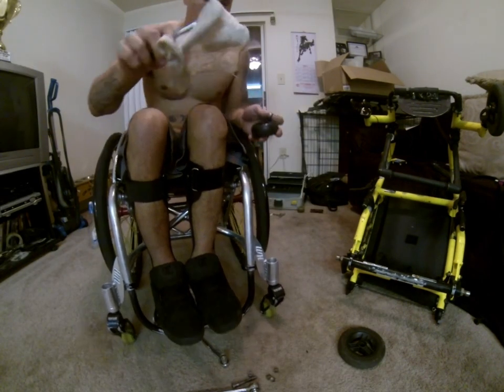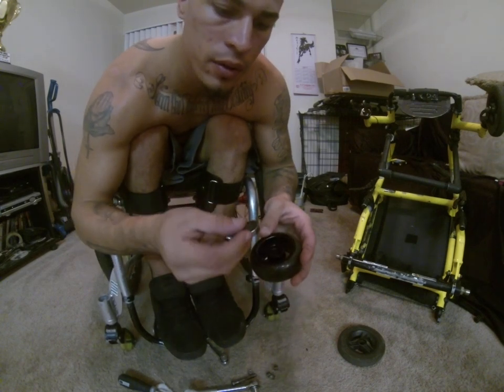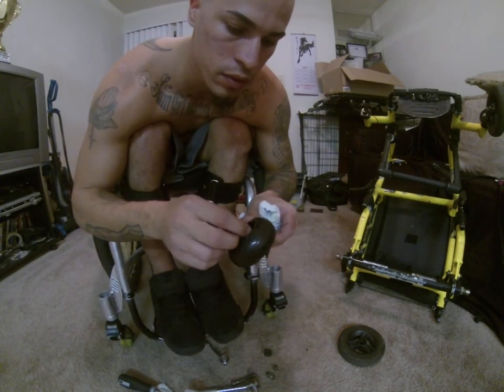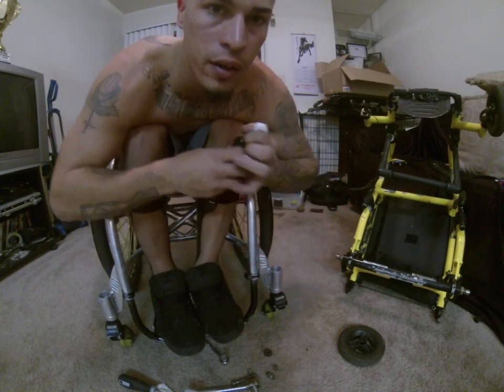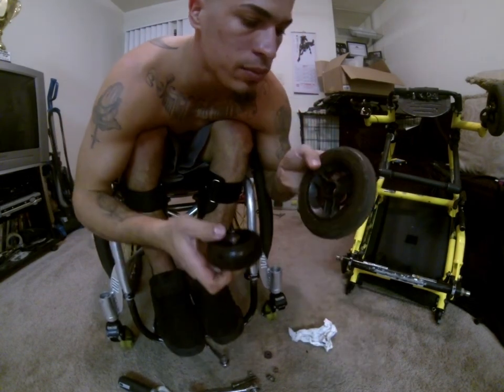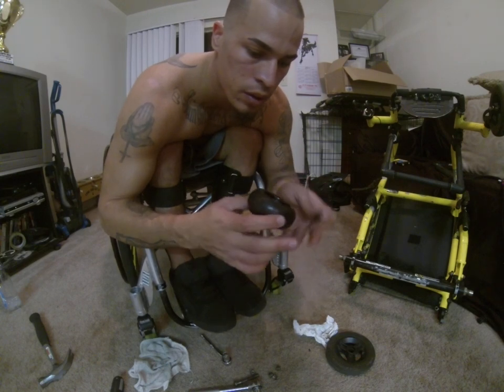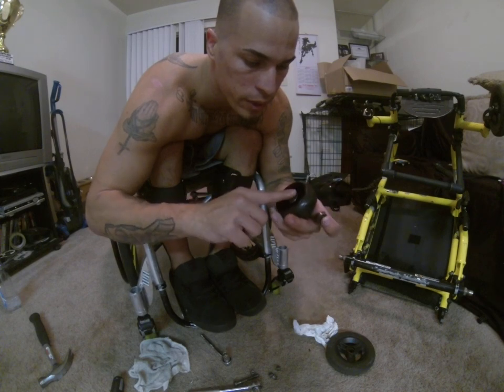Okay. So, in case they might be hard to pop in, just gotta lube them up a little bit. Sounds kind of funny, but if you do that, it should pop right in. So just put the old bearing inside there. Push down hard. This one's really tight, so it's not as easy as this wheelbase. It's like narrow. Alright, so I got one in. I had to hammer it down a little bit so it can fit. Just be careful you don't damage the bearing.